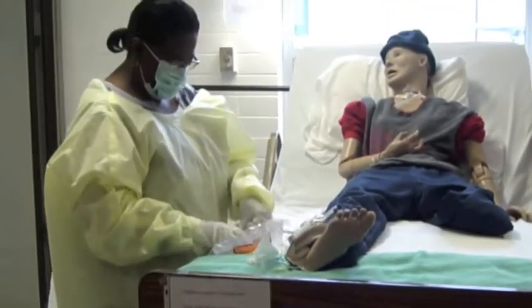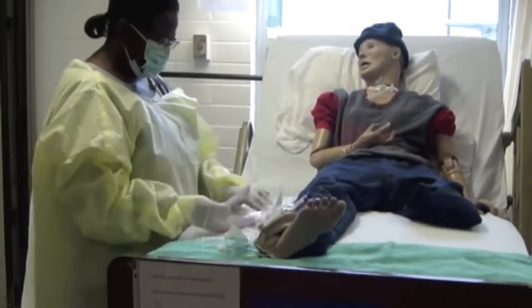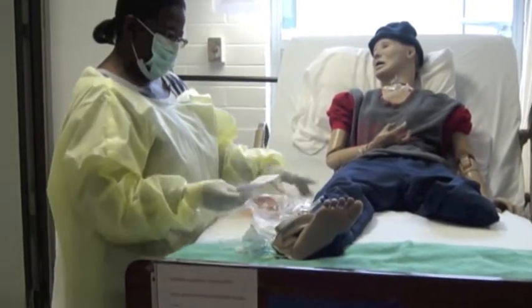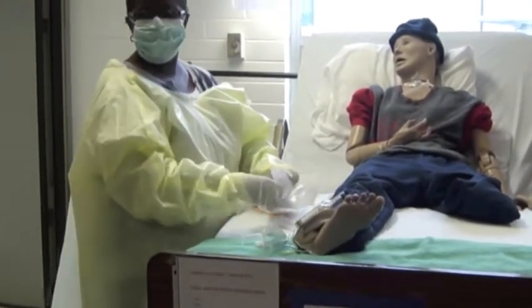Beautiful. Okay, remember, we can't take anything back out there, right? Only what we need. So, here's my label. And again, here's my form, so I want to make sure I have the time and date on the form and the site as well. You understand what I mean by that, everybody?